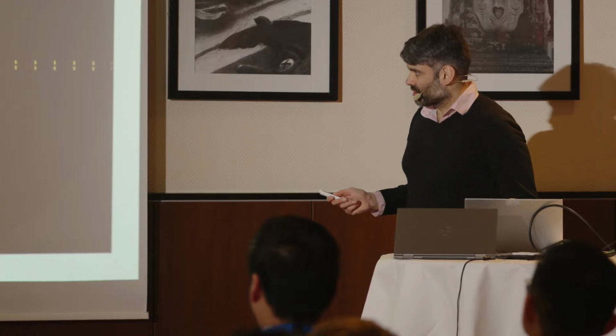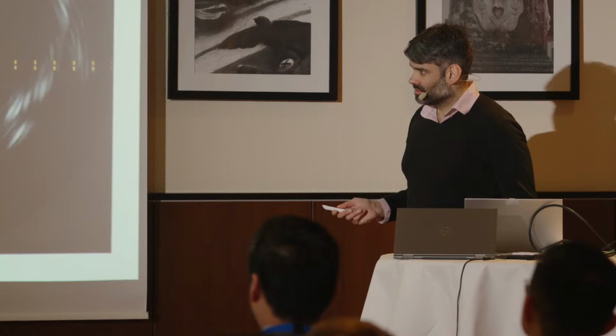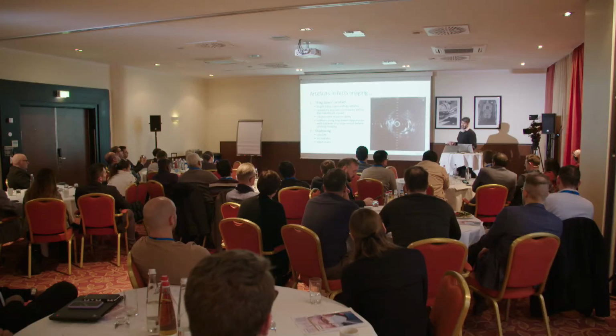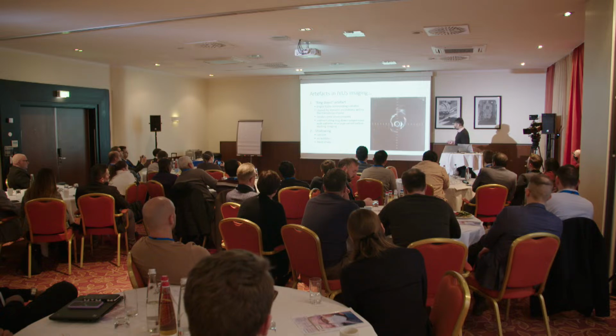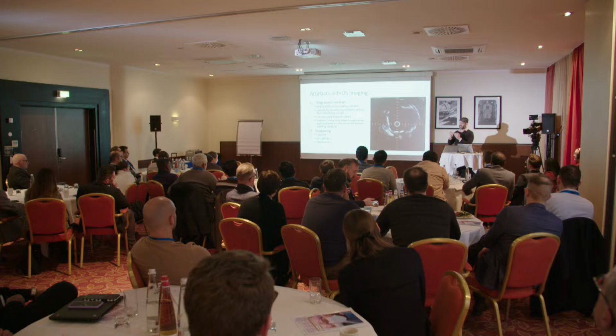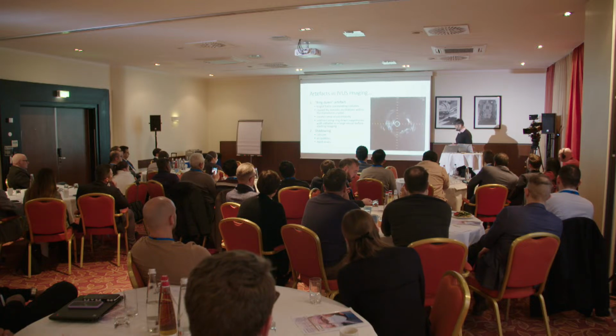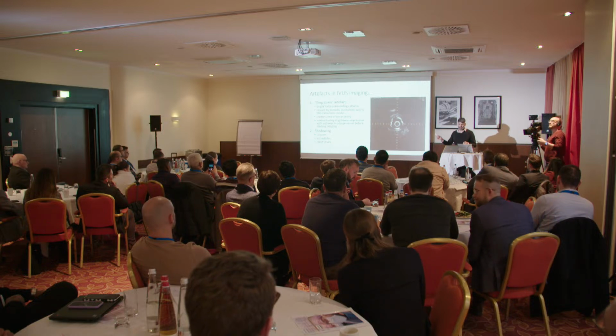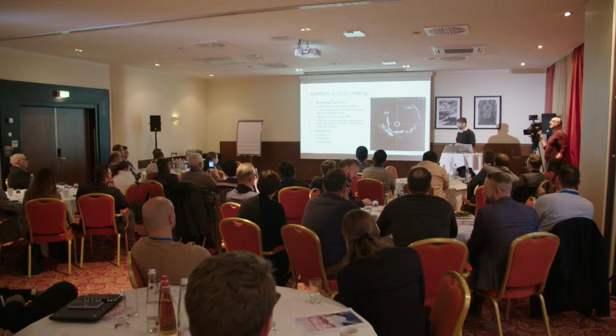Shadowing, we talked about, is what you see behind calcium. Air bubbles can also cause shadowing, and stent struts can also cause shadowing. So anything that's extremely dense, where the sound waves are going to bounce off it, you're going to get a shadow behind it. Calcium, obviously, you can't really do much about initially unless you're actually treating it, but for air bubbles you can always flush through with saline, clear the air bubble, move the leg, change the position of the air so that you can see.